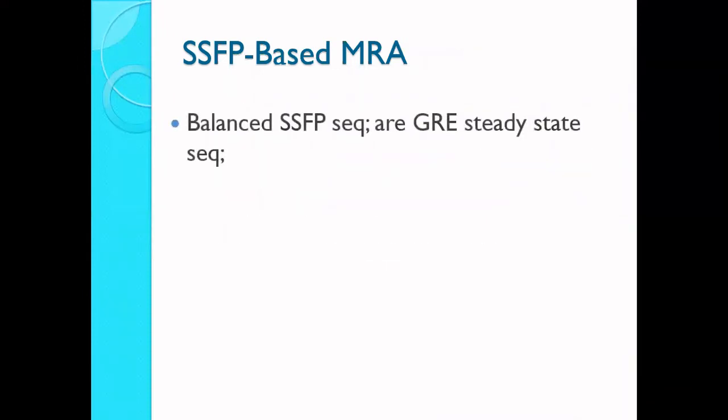Okay, and particularly in MRA, we use the balanced SSFP. This particular sequence we call the balanced SSFP because you have brought together the FID and the echo based signals, their tails, very, very close to each other, as well as you are applying rapid TRs in the train. By echo train, we mean you are bringing them together in a very close space.